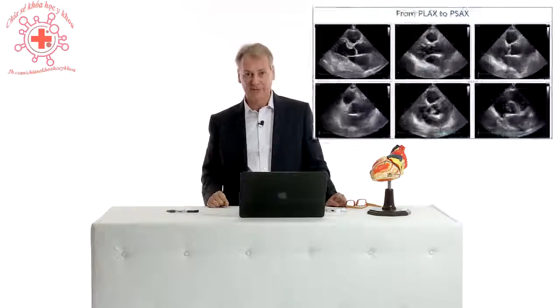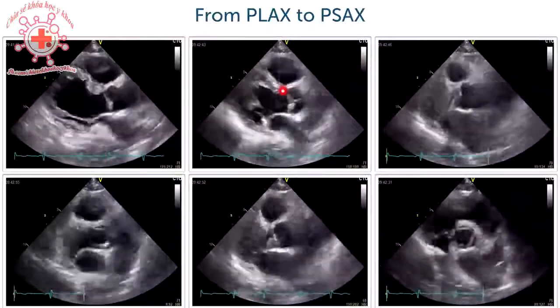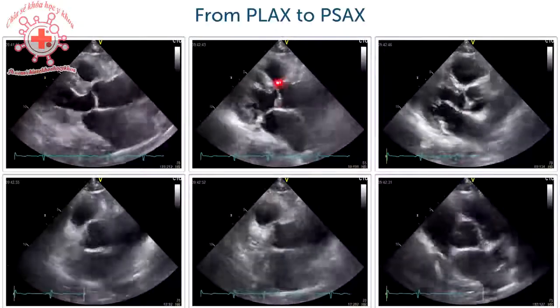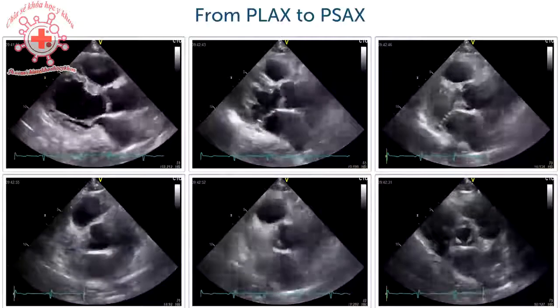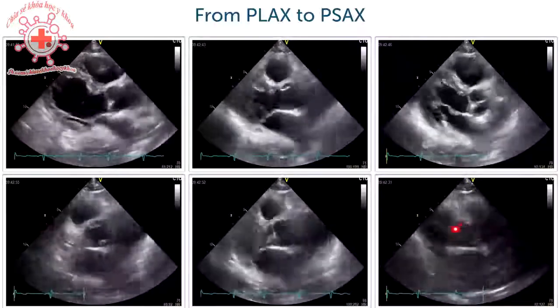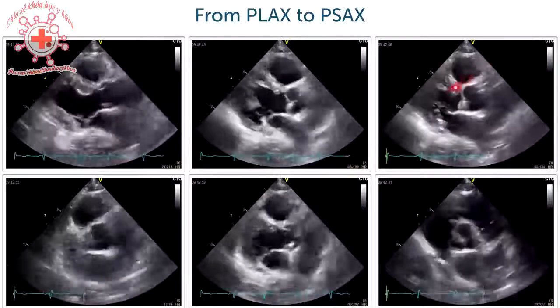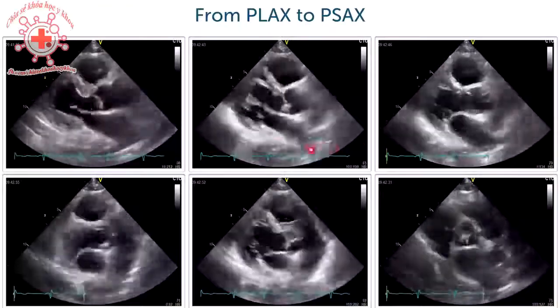My experience with hands-on training is that most people have problems getting from a long axis view into a short axis view. They do not have a stable position of the transducer on the chest — they either move or tilt the transducer. I will show you a very important way of being in control when you perform the short axis view. You start with a long axis view, and while you rotate, you will see that all of a sudden the full length of the ascending aorta will not be visible — you will lose it until the aorta starts to close. And when you have a view where you can nicely visualize the three cusps of the aortic valve, you're in the correct view.